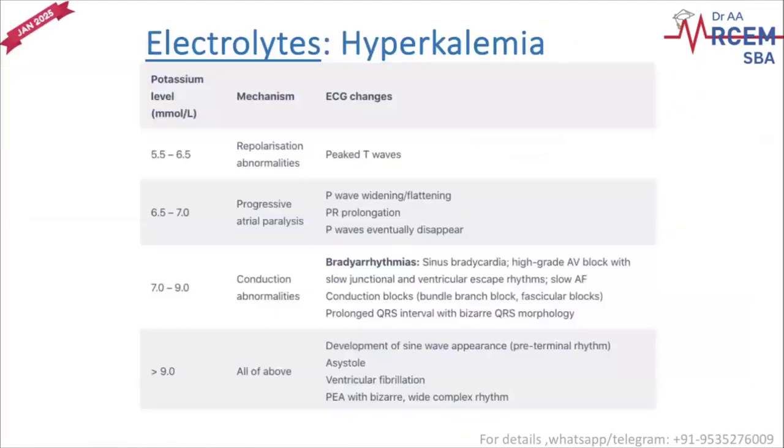Before I enter into the electrolyte abnormalities and their different ECG patterns, if anyone has any questions, you can pop up now and ask me. I do not see any questions in the meeting chat. So if anyone has any questions, just type and let me know. We'll enter into the electrolyte imbalances.